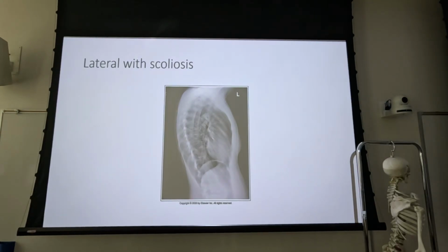So always evaluate your AP or your PA before you repeat a lateral. If you have a patient with scoliosis, you're just never, ever going to get an unrotated lateral chest X-ray. Okay, so that's a good lateral chest X-ray for a patient with scoliosis. Don't go try to correct that. You can, most of the time, get a PA or an AP that is not significantly rotated in as much as the clavicles and the spine indicate rotation. The rest of it's still going to be a disaster. But you're just never going to get an unrotated lateral.